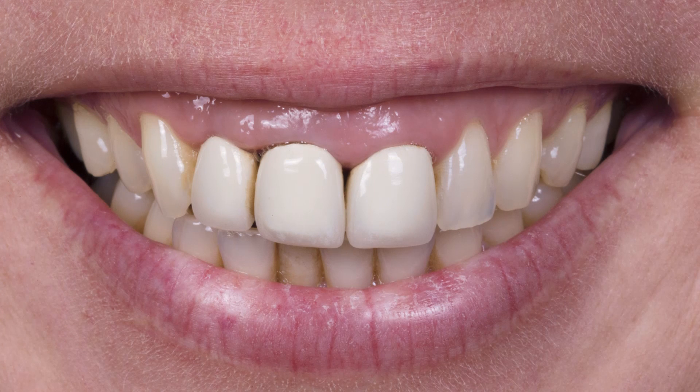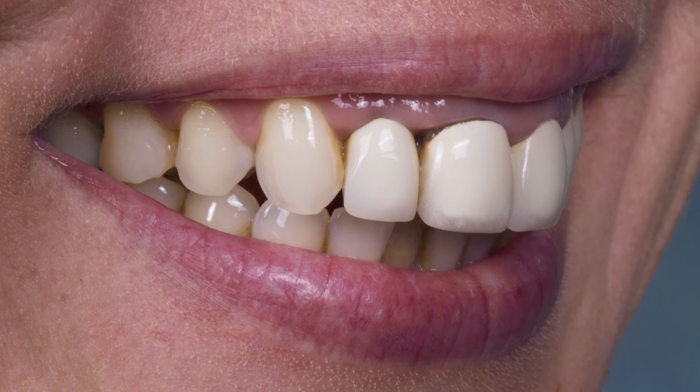This is a case where we're going to try out some Bruxer anterior crowns. As you can probably tell, there are three old PFM crowns in place, and you can see they're not very aesthetic. In fact, the incisal third of teeth 8 and 9 look like they were done by a dental technician student or a dentist on maybe their first day in dental school.